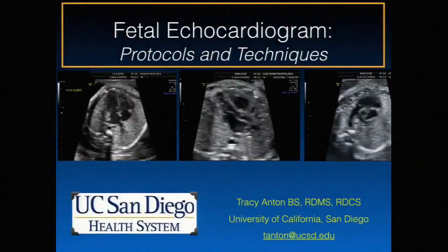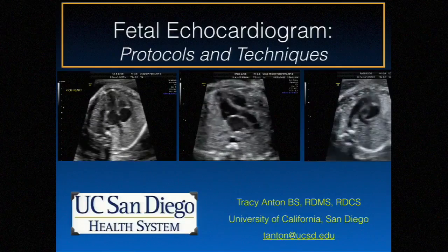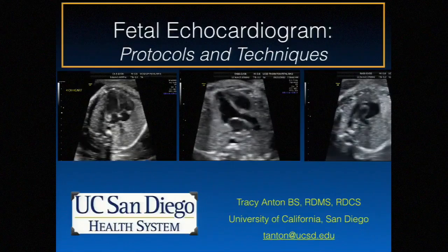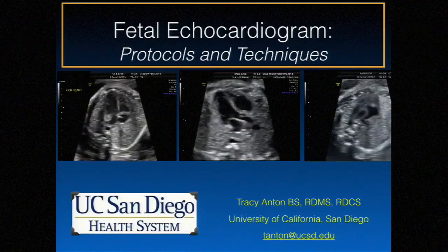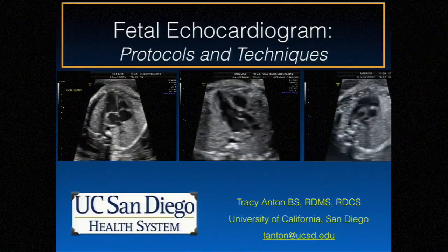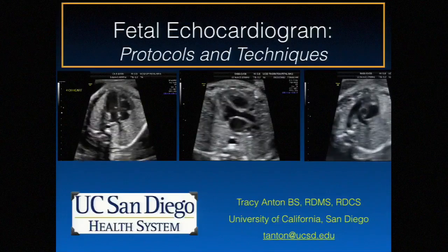So I'm going to go through the fetal echo, looking at what the protocols are in order to do a complete fetal echo, and also just reviewing some techniques. So this will be one last good review over the normal anatomy, which I think is so important to really understand as well as possible, because when you know normal really well, you will be able to recognize abnormal.